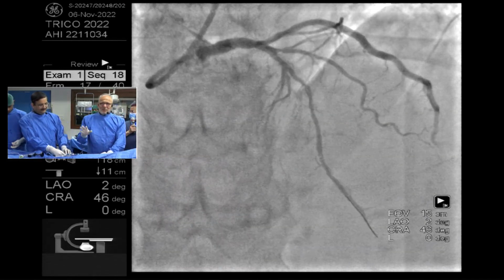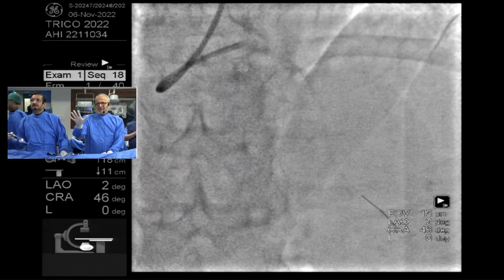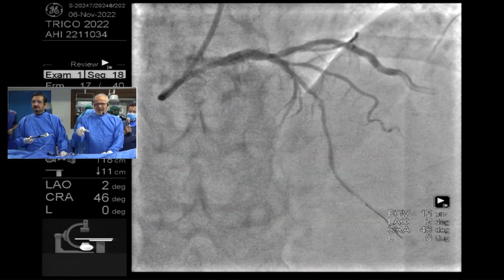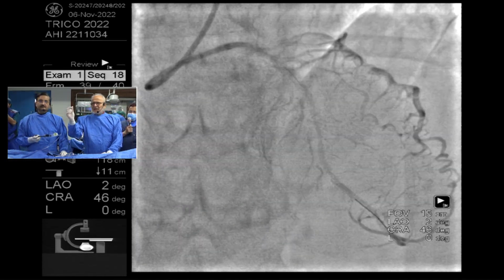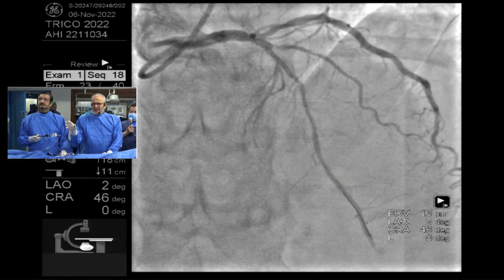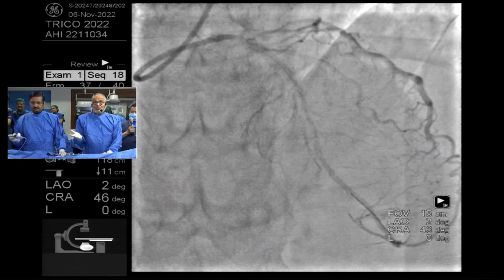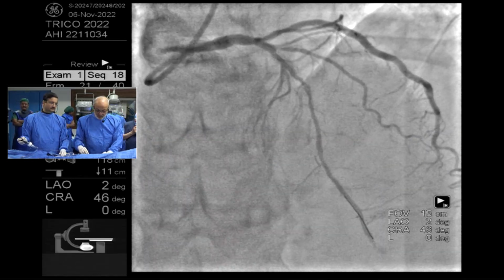See, I tell you, what my understanding of calcium management is, that with non-compliant balloon, it gives big blocks and cracks. With rotational atherectomy, you will see some churning at the wall of the artery. You will realize that rotational atherectomy has been done. And with IVL, it is pulverization, and sometimes you don't see anything and you see a little better lumen. This, without balloon dilatation.